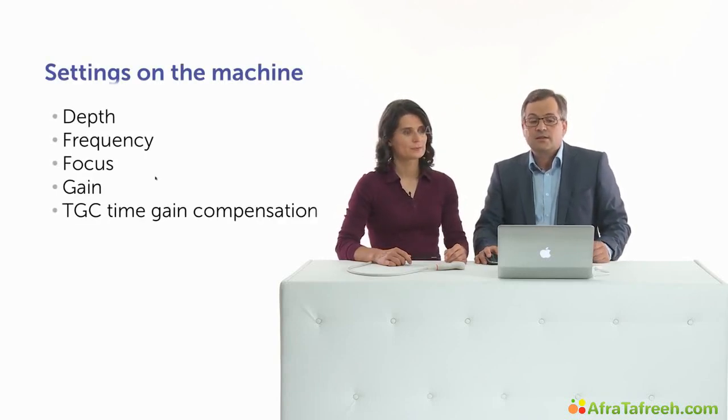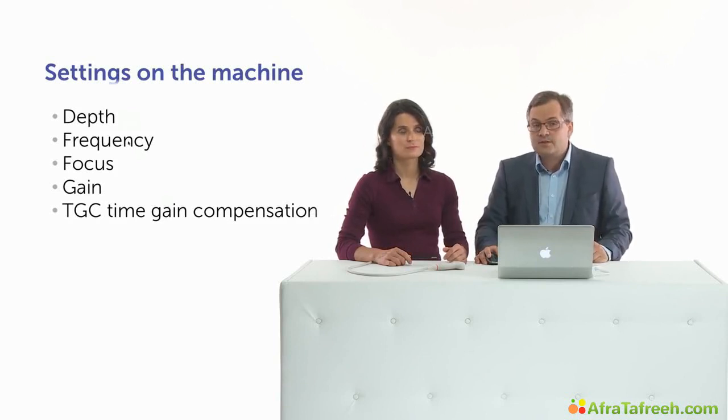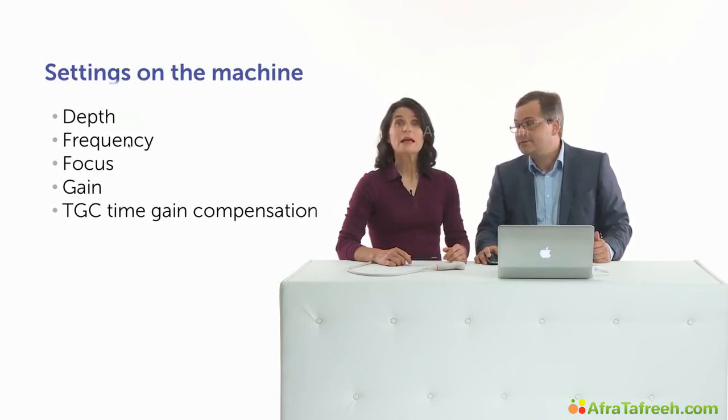Before performing an ultrasound examination, the following settings have to be selected: depth, frequency, focus, gain, and TGC, so-called time gain compensation. It is essential that we take enough time for these presettings. For every patient and for every machine, adjustments have to be made. With some practice, an image can often be significantly improved.